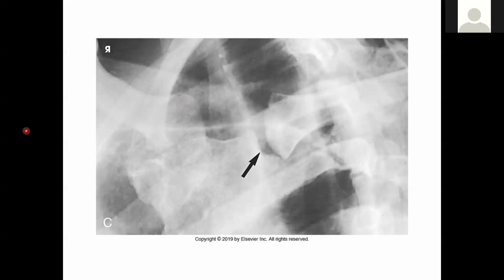Your collimation should stay the same, fairly tight, and your centering shifts about 1 inch or 2 to the upside. You should not need to do much more than turn your patient and let the light field take care of itself.